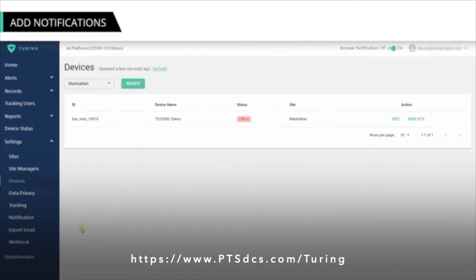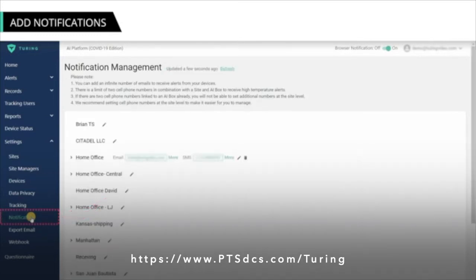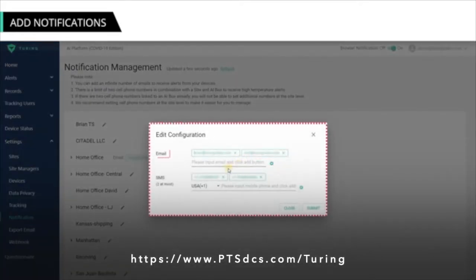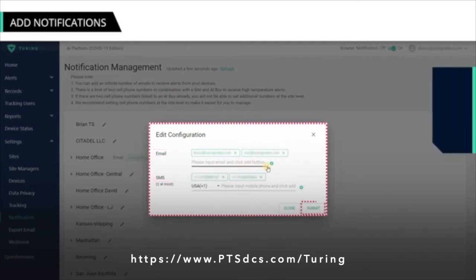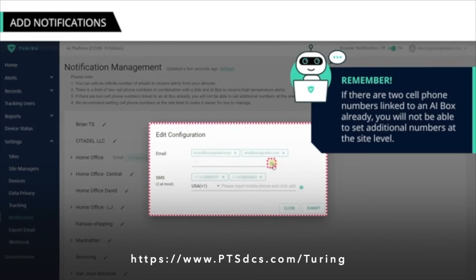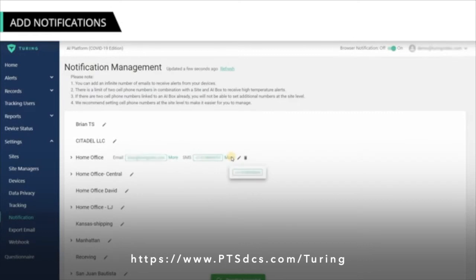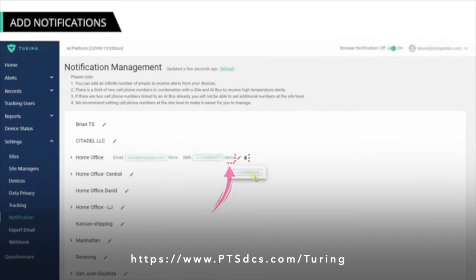Using the Data Access Management Platform, you can set up notifications to allow specific individuals in your organization to receive real-time high-temperature alerts via SMS or email. To manage notifications, from the Settings menu select the Notification option. This will display the Notification Management page. To set up a phone number and email, click the Edit icon. On the Edit Configuration overlay box, enter email and SMS details and then click Submit. If necessary, click the plus icon to add another phone number or email address. You can view the additional phone number linked to the device by clicking More, and use the Delete icon to remove details.